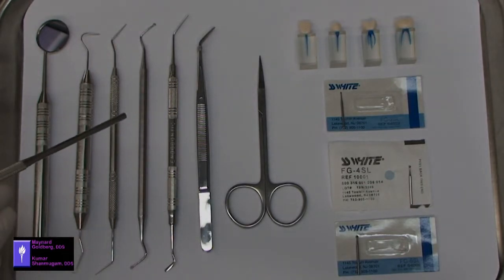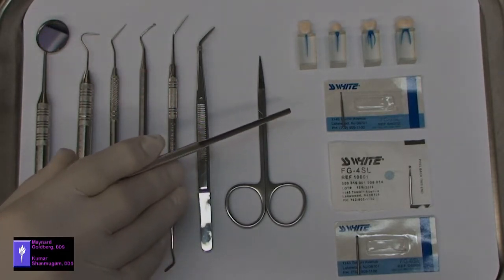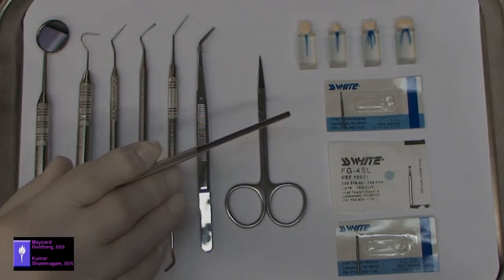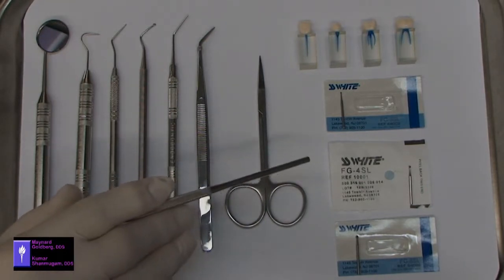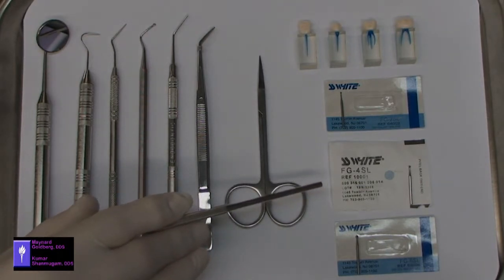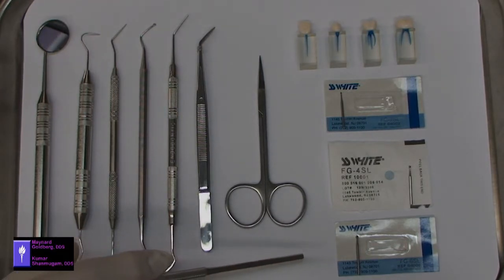and friction grip. The number 2 is generally used in a mandibular incisor, sometimes in a premolar. The number 4 is generally used for the maxillary anterior teeth as well as premolars. The number 6 is used for the maxillary and mandibular molars.